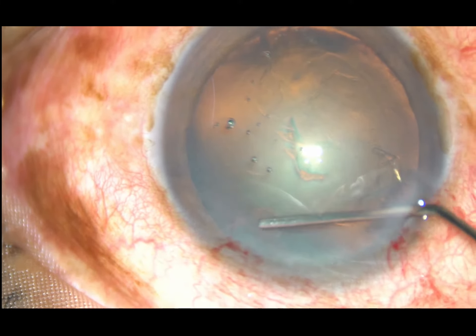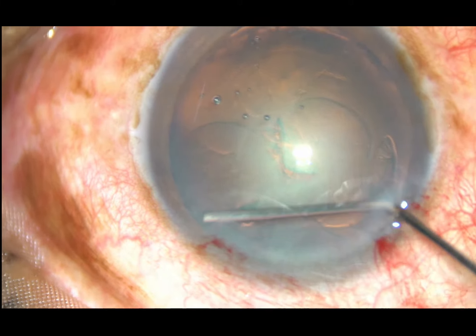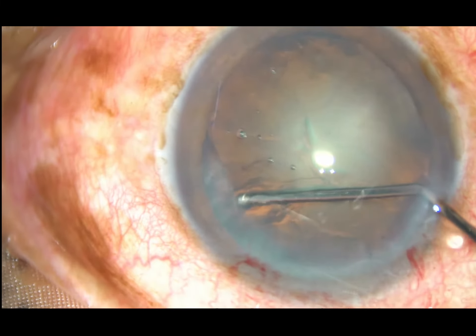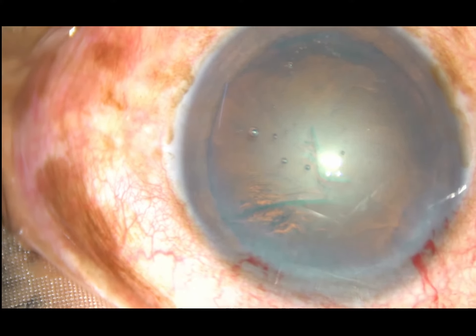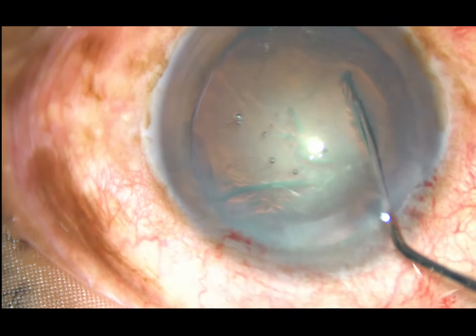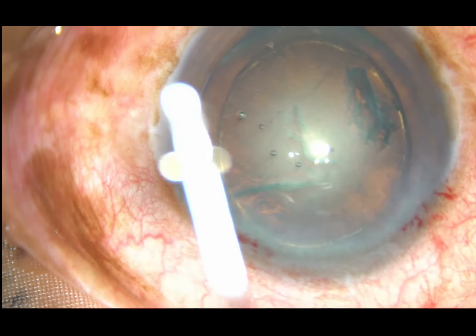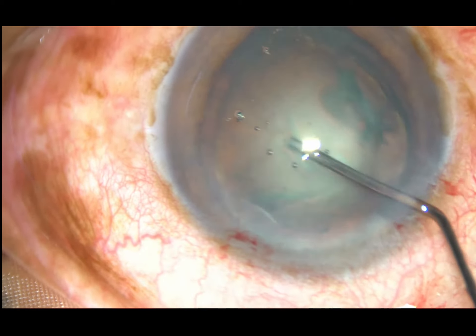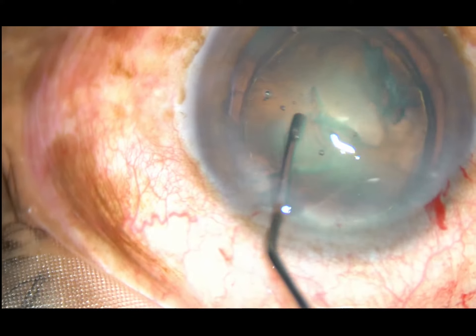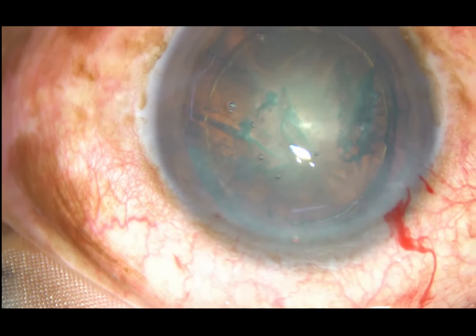Now hydrodissection is done. The fluid wave is passed just underneath the anterior capsular rim, going up to the equator — the fluid wave should go from this side to the opposite side. Now tap the nucleus and let the fluid wave come anteriorly along the equator. Then do hydro-delineation, which separates the nucleus from the epinucleus.